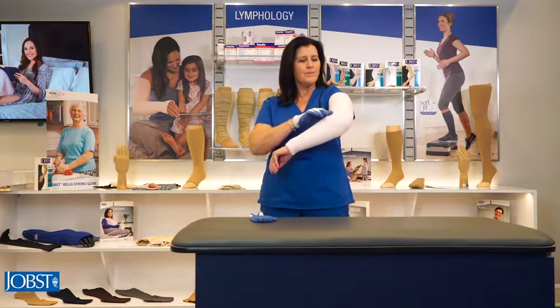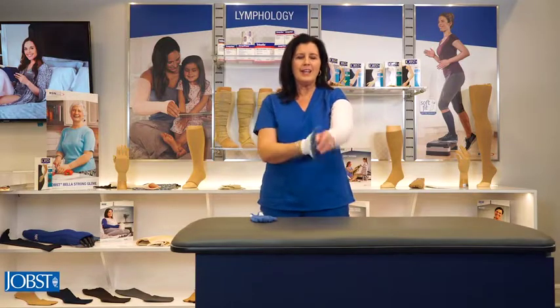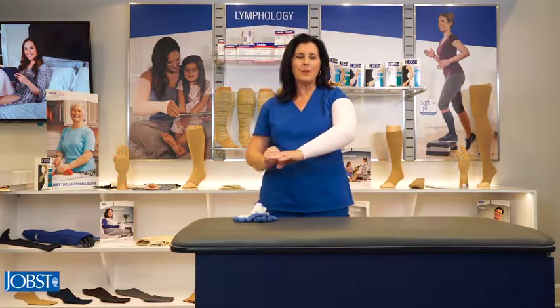We want to make sure that the elbow seams are aligned at the elbow and that the garment comes completely to our wrist. And there you have it — your arm sleeve is on.